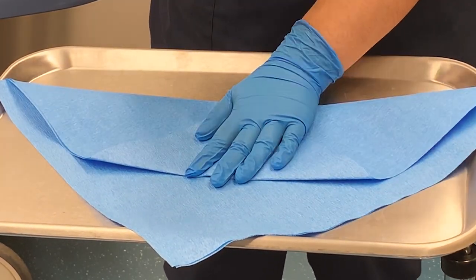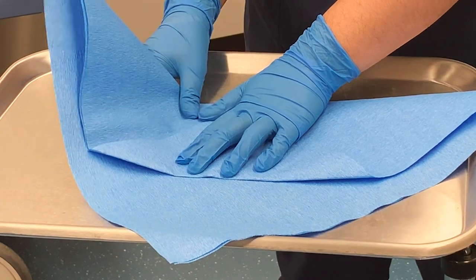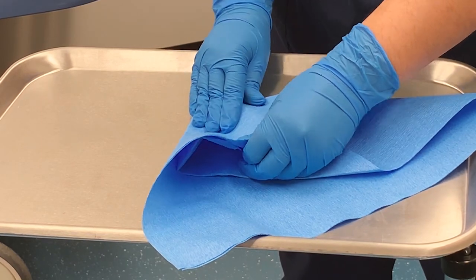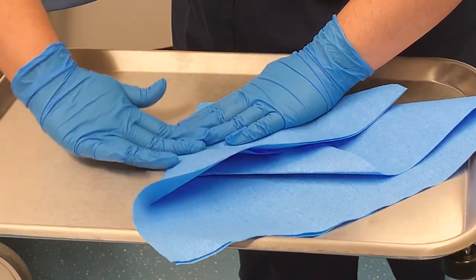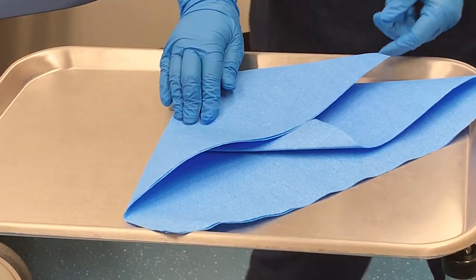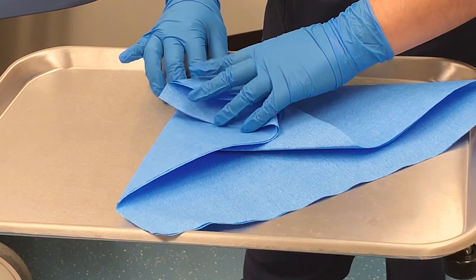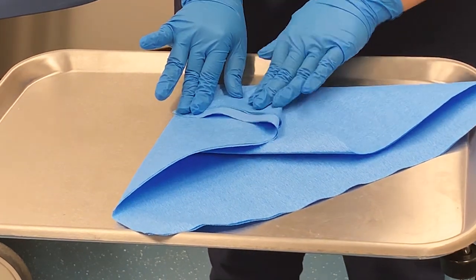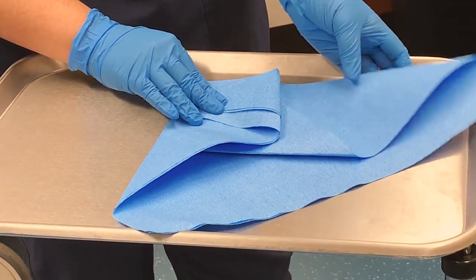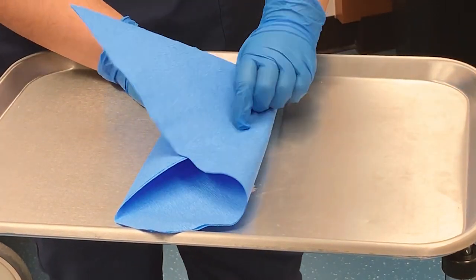Next, you're going to grab the left or right side of the paper. Feel where your instrument is with your hand, and bring the paper all the way towards the center.